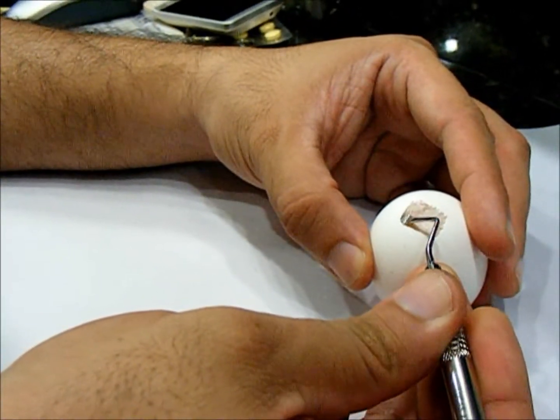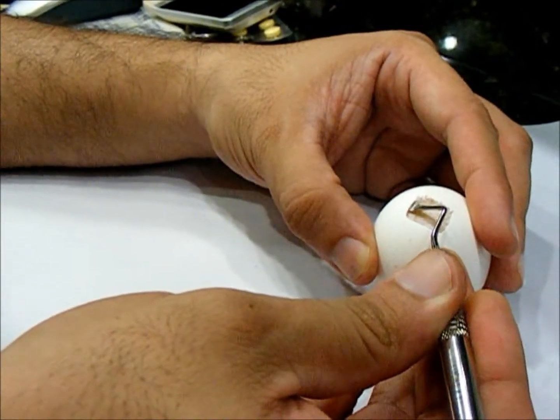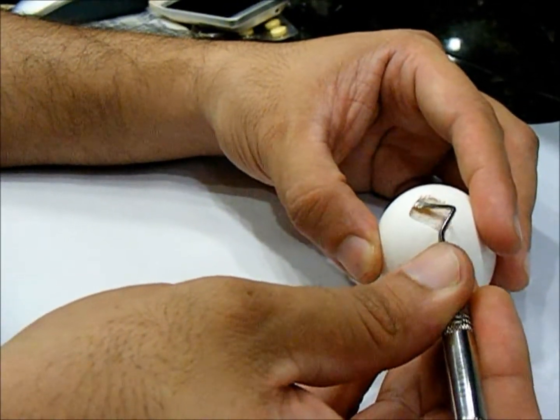Worst case, you lose a few pennies on an egg — and not even that, because if the instrument is sterile, you can go ahead and fry the egg and enjoy a nice hearty breakfast.